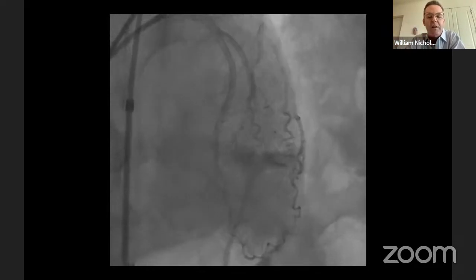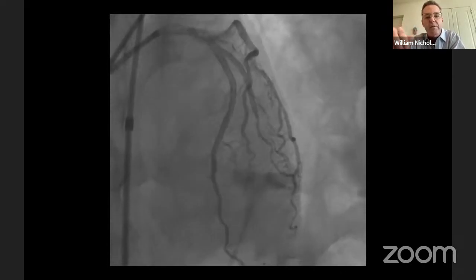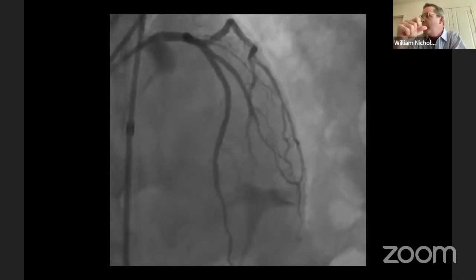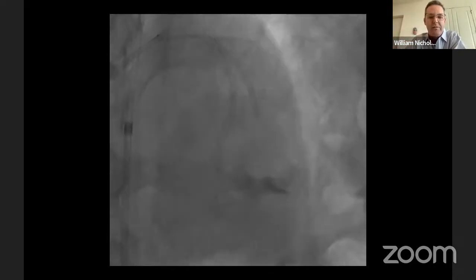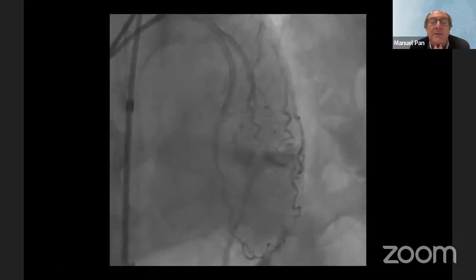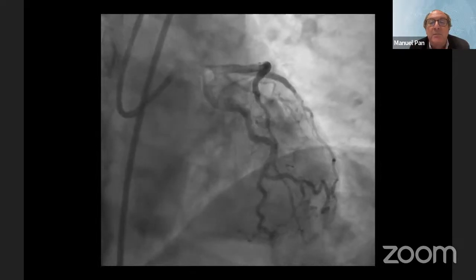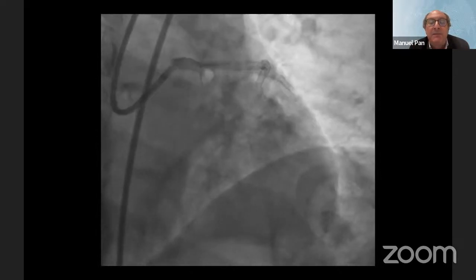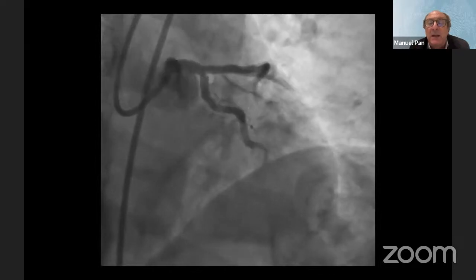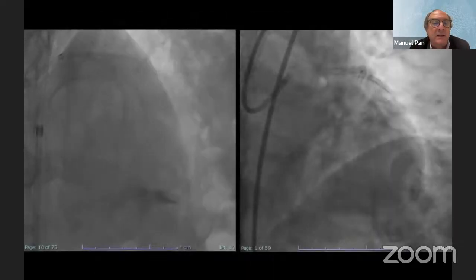It exemplifies a lot of the things in your very nice article that I think are really germane to this case. So I appreciate your comments, or if you have any commentary or congratulations for the excellent result, because it's a very complex case with two bifurcations. It's a CTO with two bifurcations at the level of the left main and at the level of the LAD diagonal. So an excellent result and excellent technique.